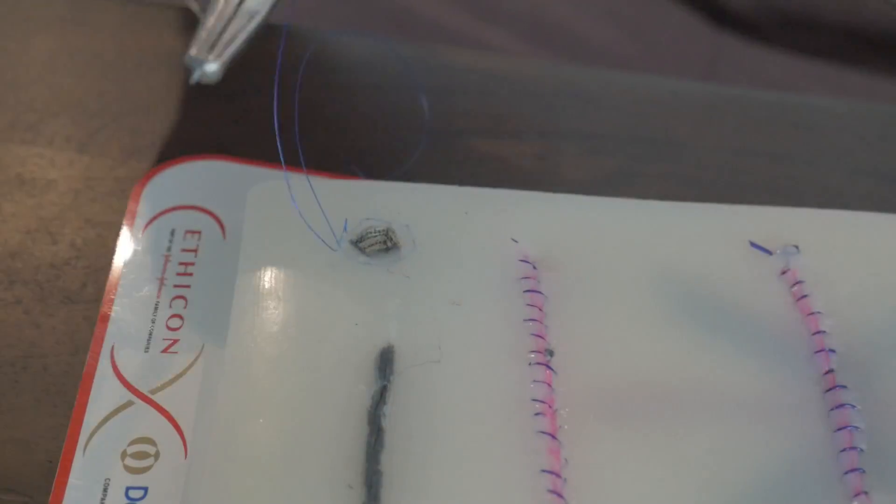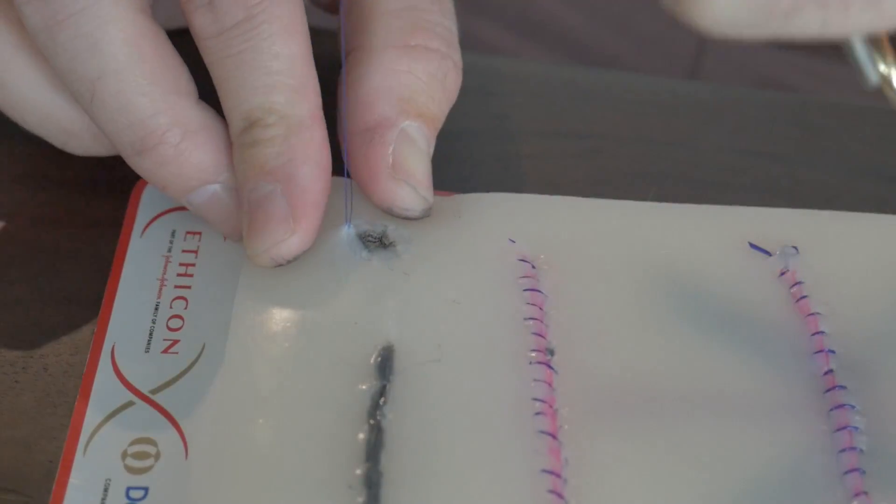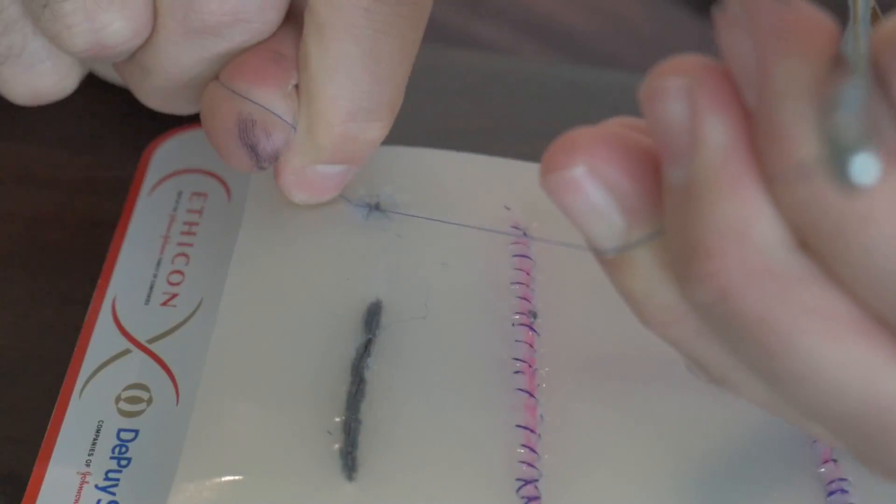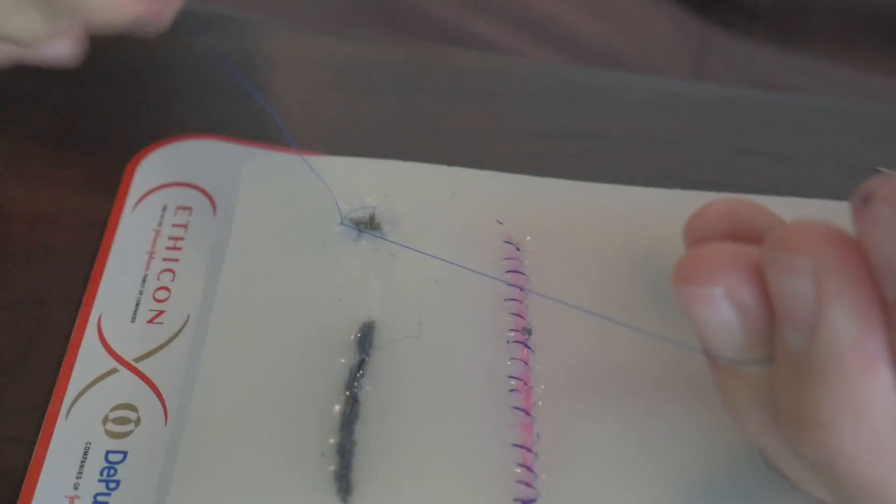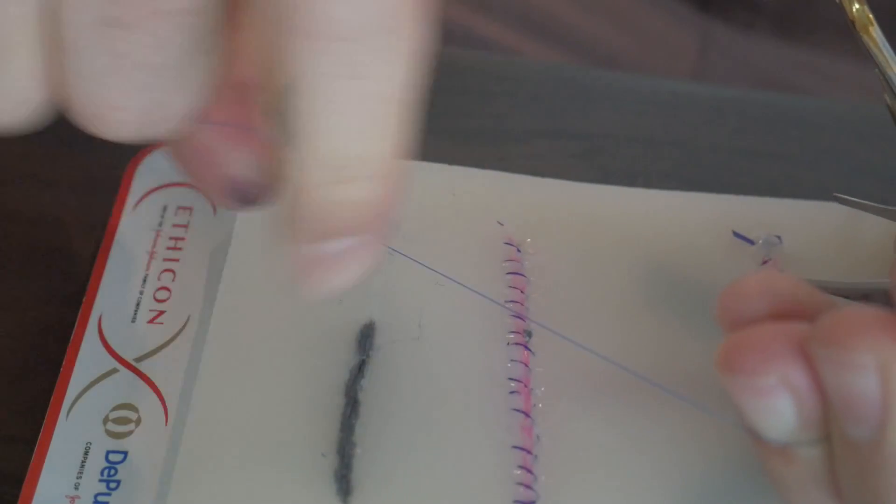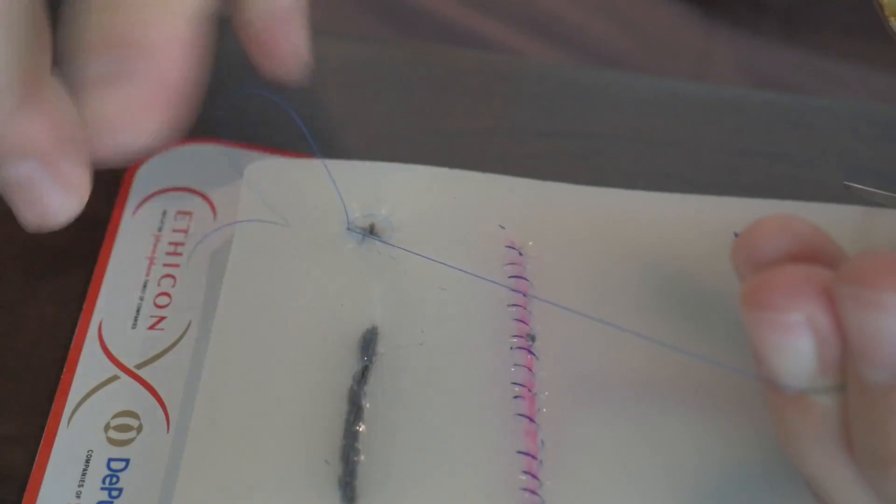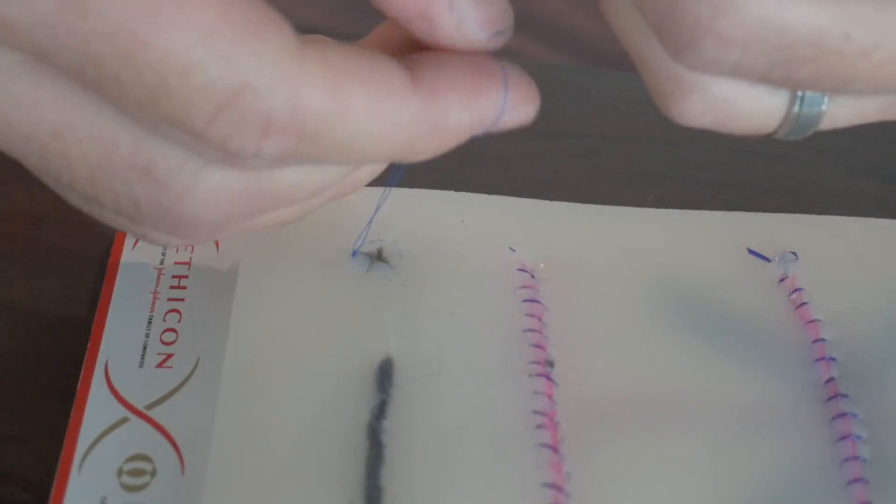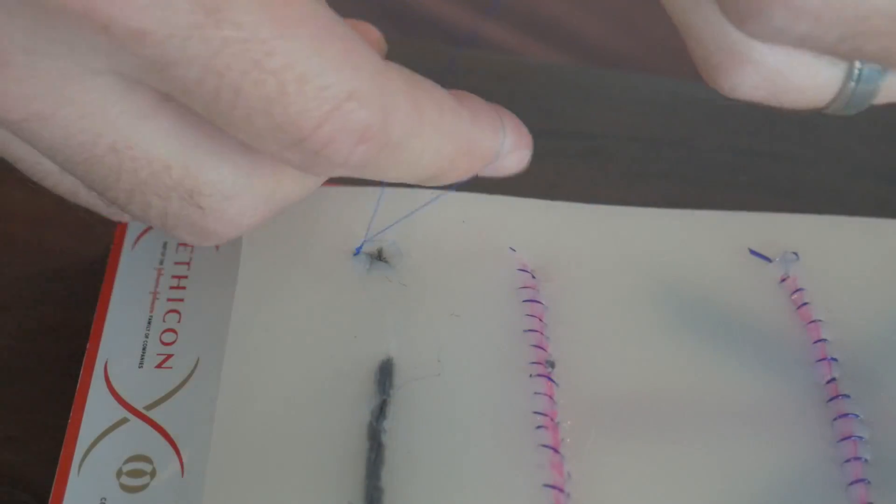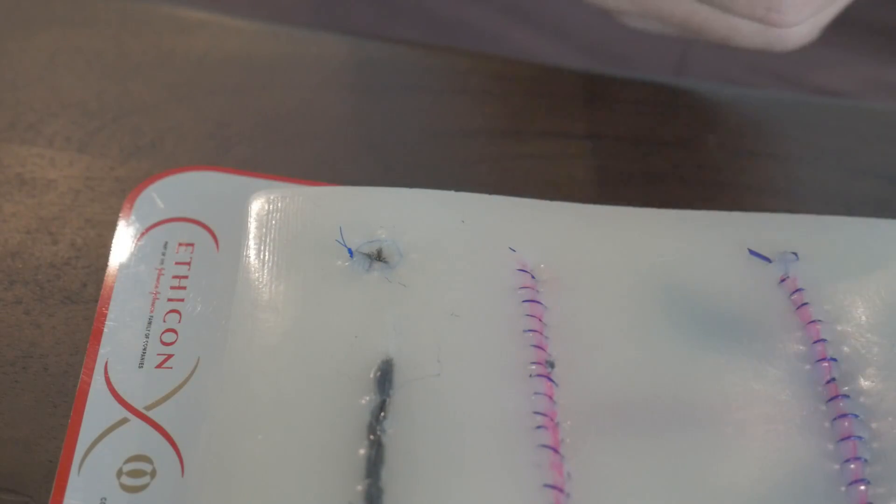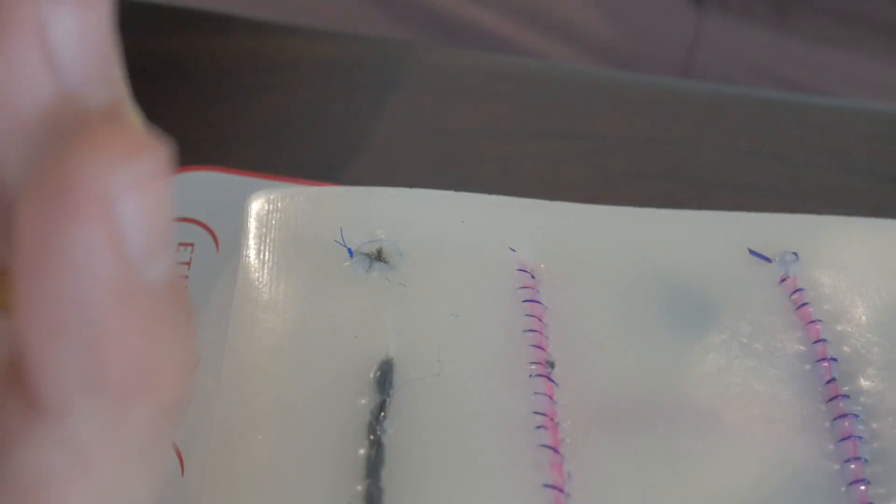But as you can see here, I've made the full circle around the incision. I'm going to pull up on both of these sutures to see how it kind of closes together. This fake tissue is super plasticky and very difficult and my hands were slipping on the Prolene here. So it was really hard for me to tie a knot, but normal tissue would close a lot easier than this. But you get the gist of it here as I'm tying the knot down. You see that hole gets smaller and smaller and smaller and it will close up any type of circular wound or incision.